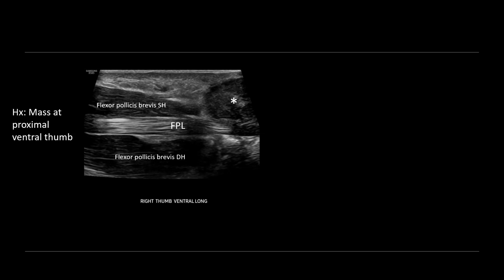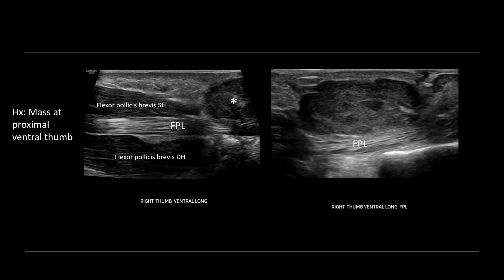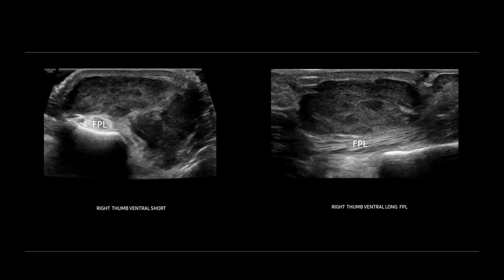So let's move the transducer down a bit more distally. In that same orientation, we can see the flexor pollicis longus tendon here. There's the proximal phalanx of the thumb. And overlying the tendon, we see this lobular hypoechoic solid-appearing mass. If we turn short axis on the mass, we can see that it's lobular, partially encasing that flexor pollicis longus tendon sheath as it overlies the proximal phalanx.